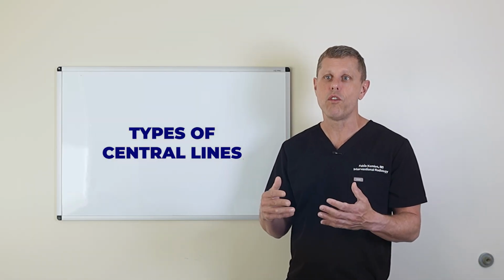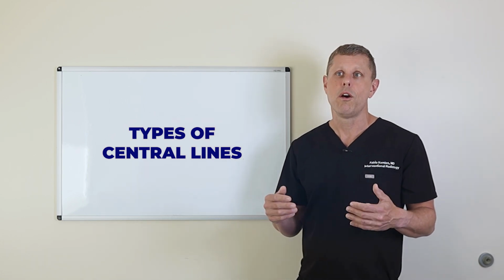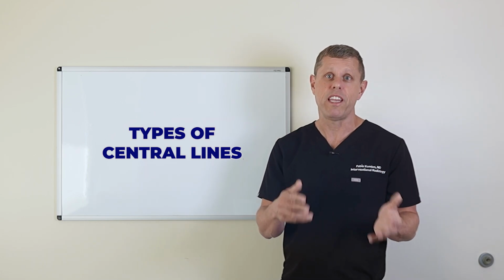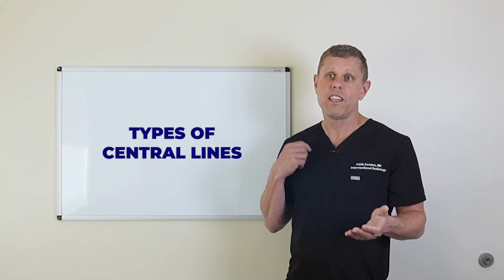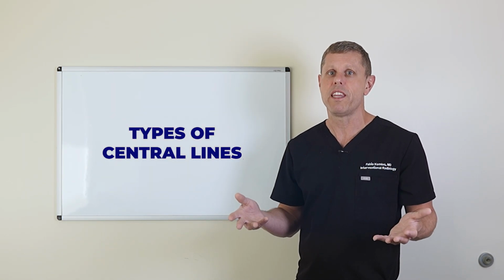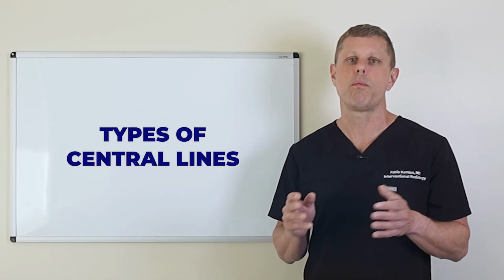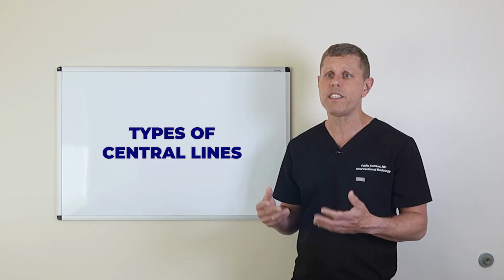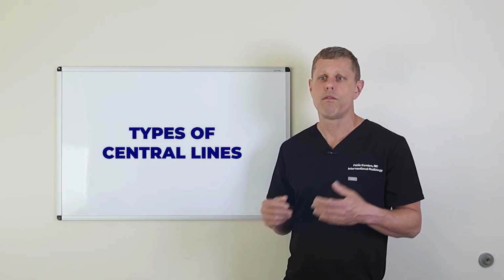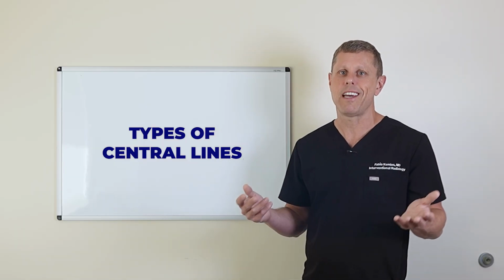So it's very useful for patients that need an IV frequently, let's say once a week, but they don't need it every day. If you need an IV every day, you would always need this needle in there, and so it kind of defeats the purpose. In those cases, we tend to prefer a tunneled line or a PICC line. But there are some patients that need an IV every day, for example, for TPN, and they prefer a port, although I think it's less ideal for that.